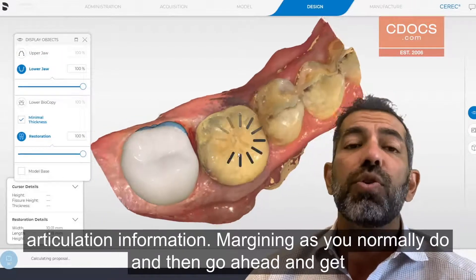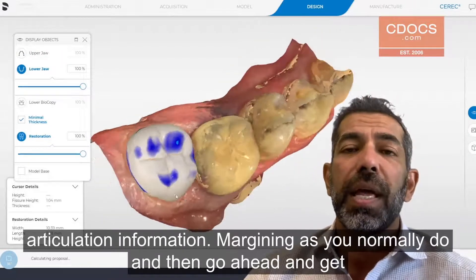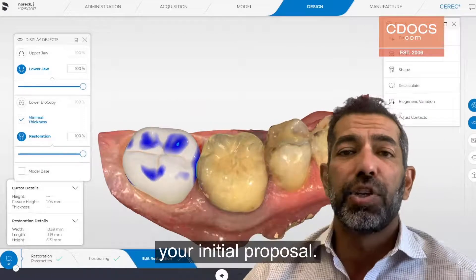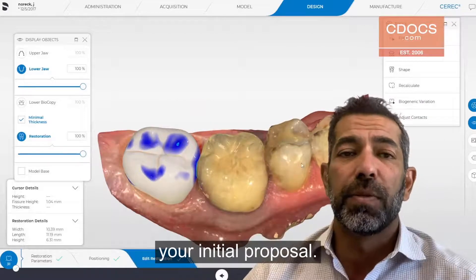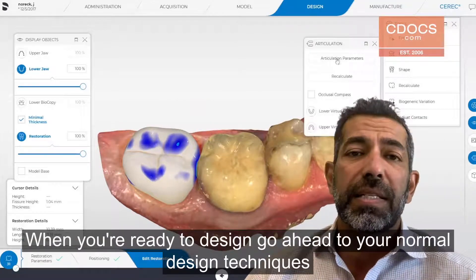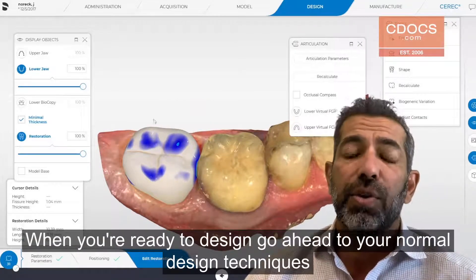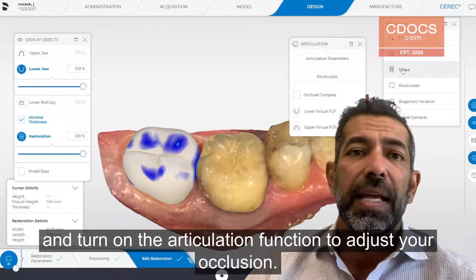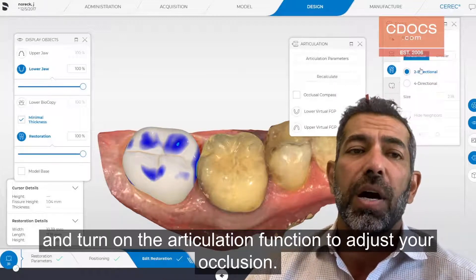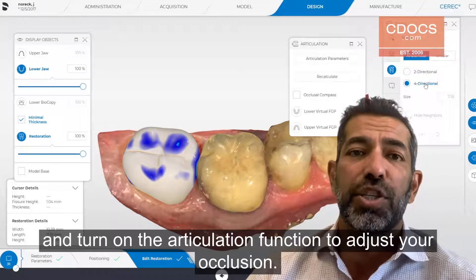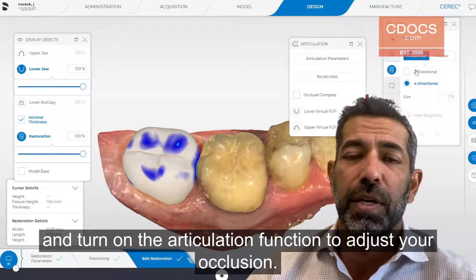Marginate as you normally do and then go ahead and get your initial proposal. When you're ready to design, go ahead through your normal design techniques and turn on the articulation function to adjust your occlusion.